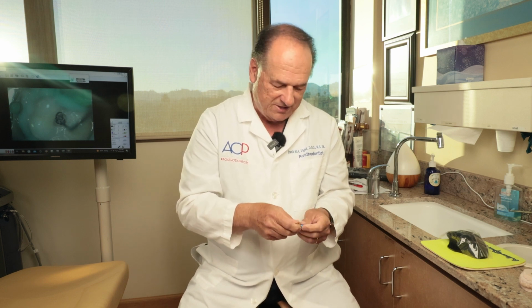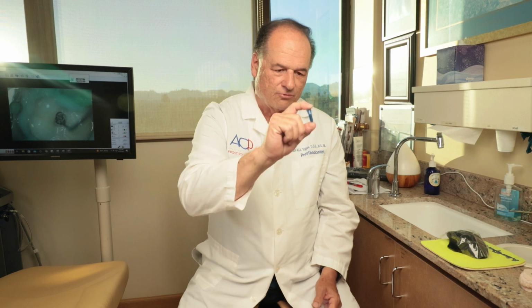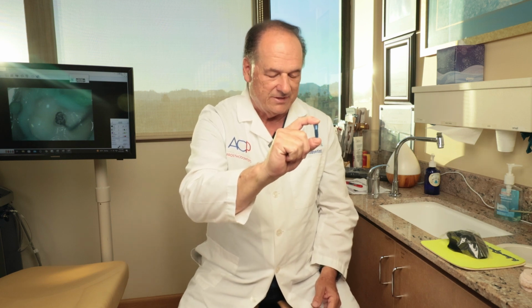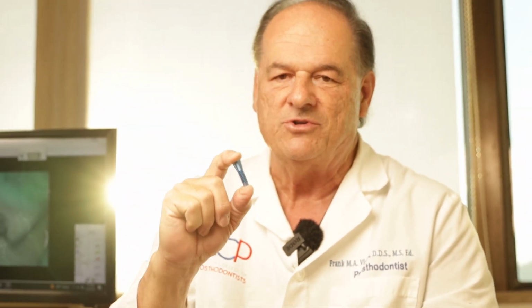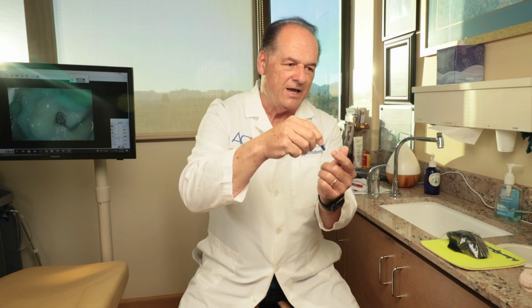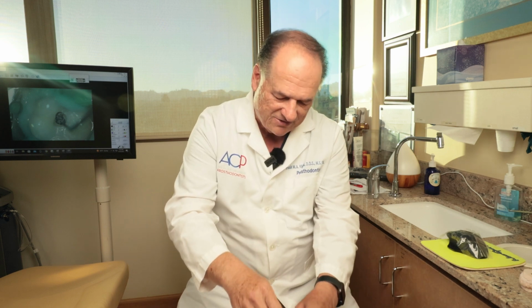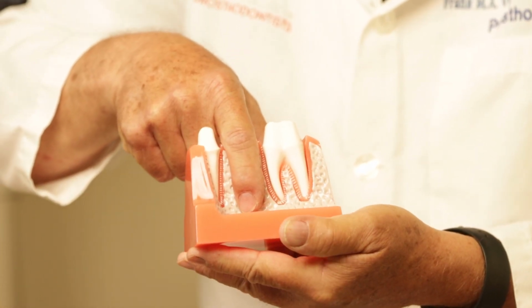That's something that needs to be made very clear, because even though at the end of the process it may look like a tooth, the root now is this. It's some sort of metallic structure, typically titanium. There are some newer ones made from zirconia, but they all look pretty much the same. They have some form of a screw, a thread, and it is eventually placed into the bone.